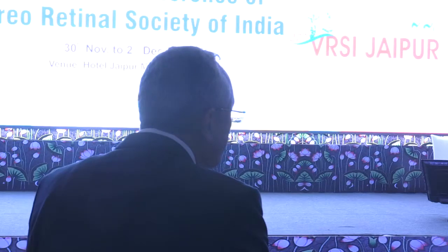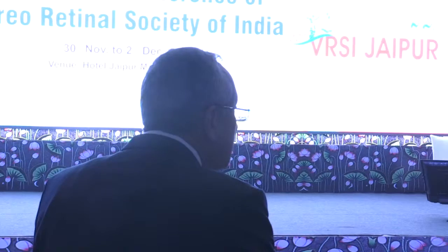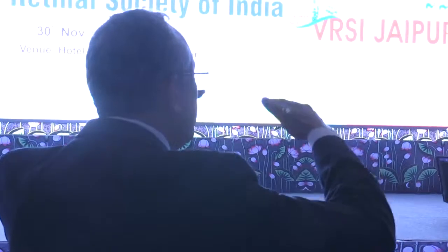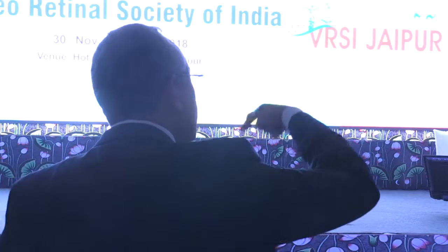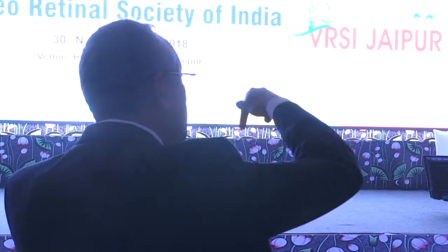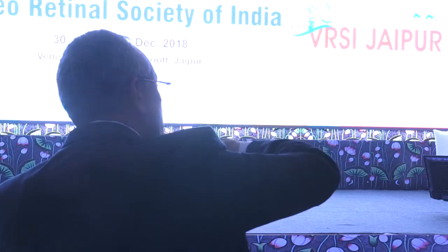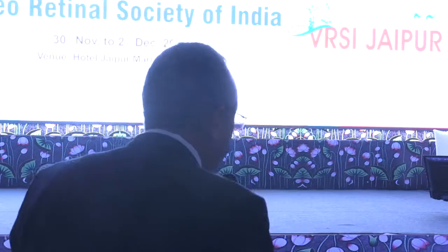So how do you avoid RPE detachment? Because if you're not in the right plane, instead of a retinal detachment. Yes, this is a good question. I start the injection before I penetrate the retina, so that once I get into the subretinal space, immediately you get this bulla and you don't advance more. If you start penetrating the retina and then inject, you may get beneath the RPE. But if you start above the level of the retina and continue advancing, once you get in the right place, the retina will elevate and you stop advancing. Great.